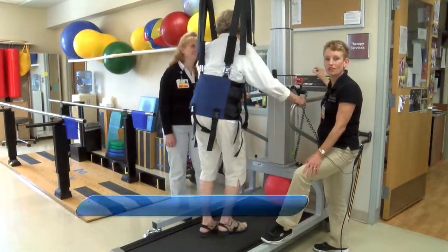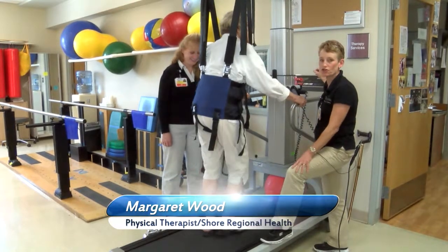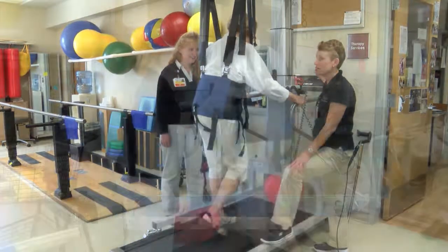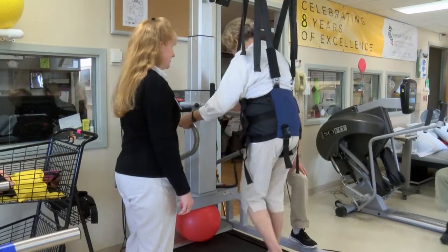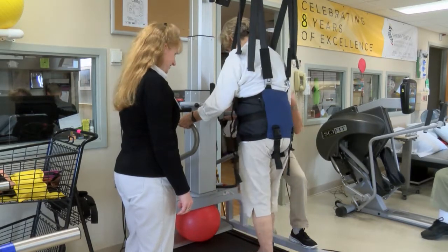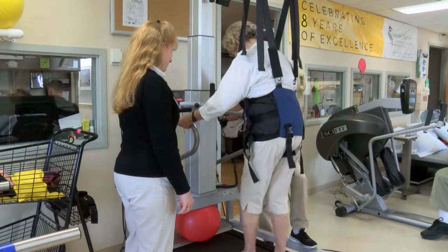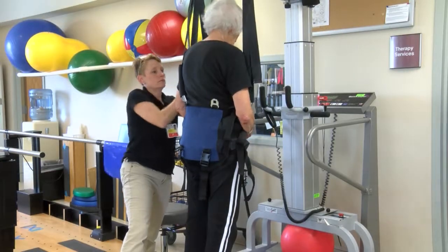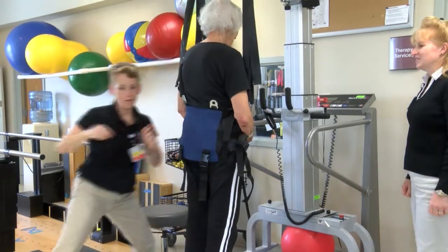Here we have our light gait harness and we're using it in conjunction with body weight supported treadmill training. This system is very useful for physical therapy so that we can increase the patient's ability to take many repetitions of steps during our gait training. By using this harness we can actually lift the patient up to take some pressure off of their lower extremities, making the act of walking easier for them.